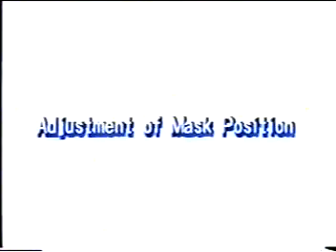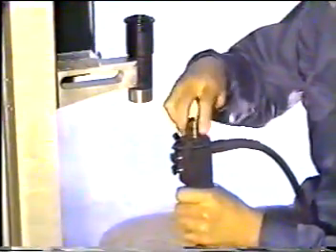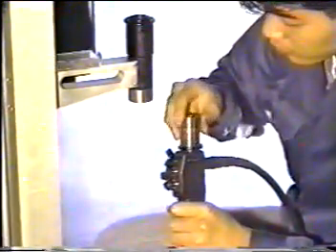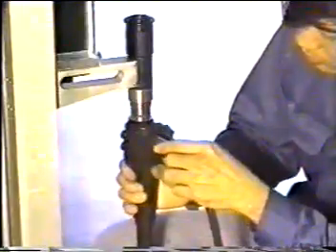Adjustment of the eyepiece lens assembly, EYP. Alignment of the mask position. Remove EYP. Remove the inner ring and attach eyepiece master jig J32151. Set the scope to the jig JA3009.